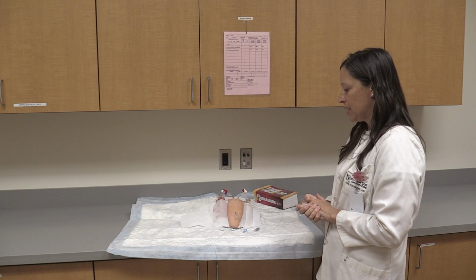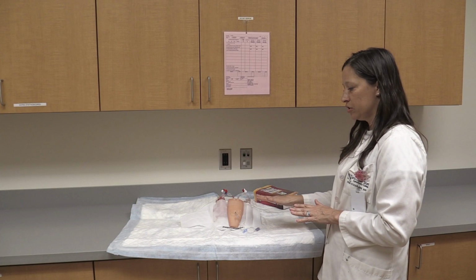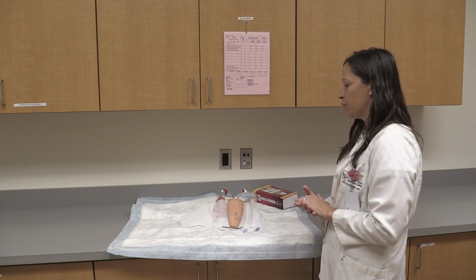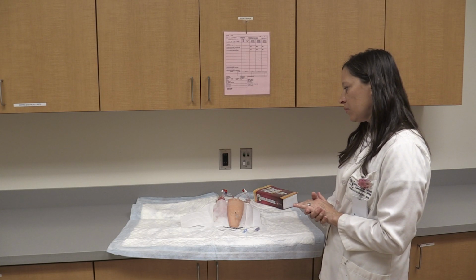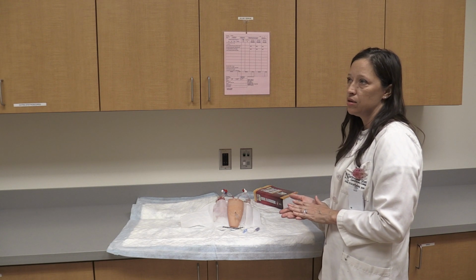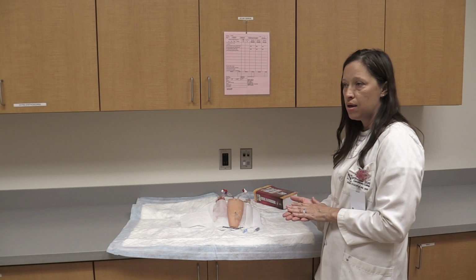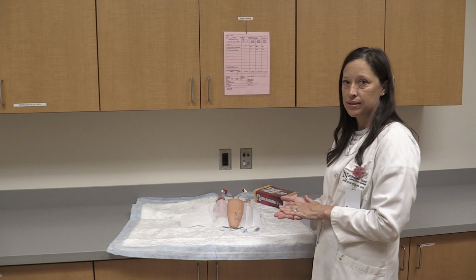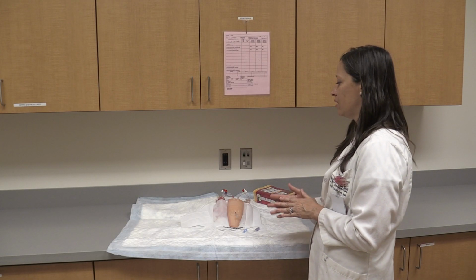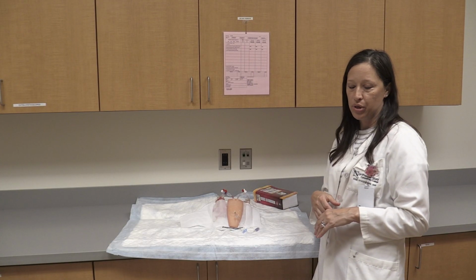I'm going to do all of that, and then I'm going to make sure that their IV site is appropriate. It looks good, no signs of infection or infiltration. And then I'm going to ask the patient if I can take their vital signs, because I want to make sure that their blood pressure is stable, their respirations are stable, their oxygen saturation is good, because I know that morphine is a respiratory depressant. So I want to make sure that it's pertinent for them to have this medication. So once I've determined all of that, I'm going to go into the med room and get my supplies.